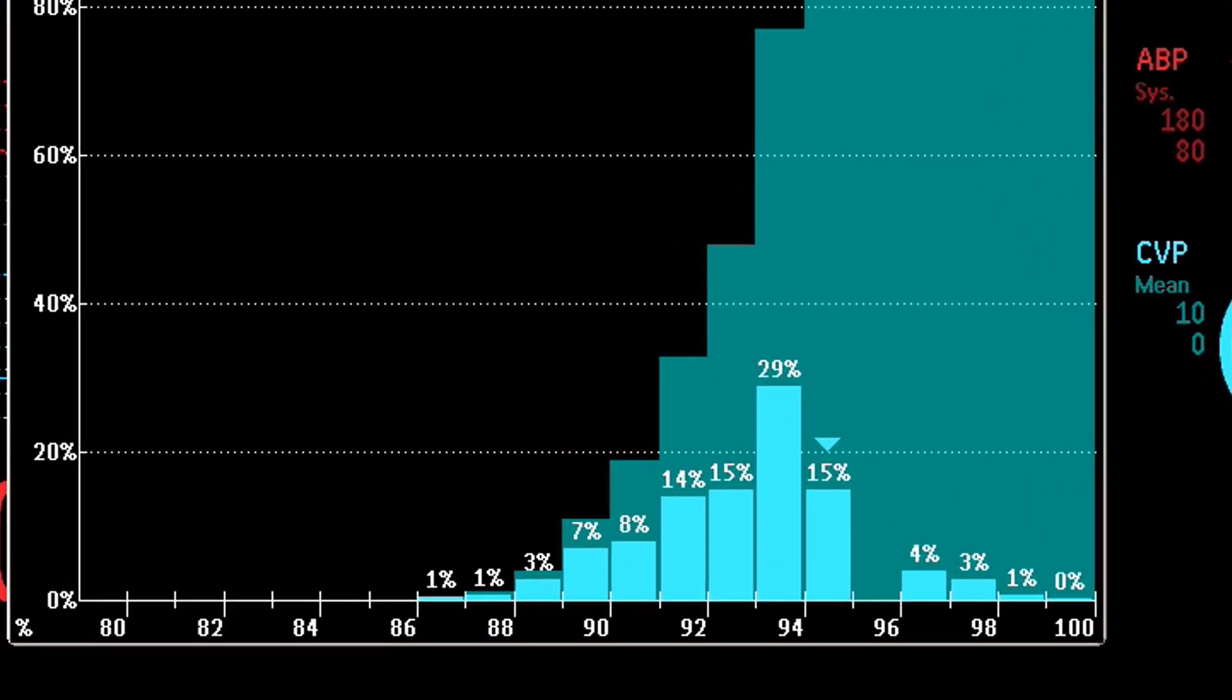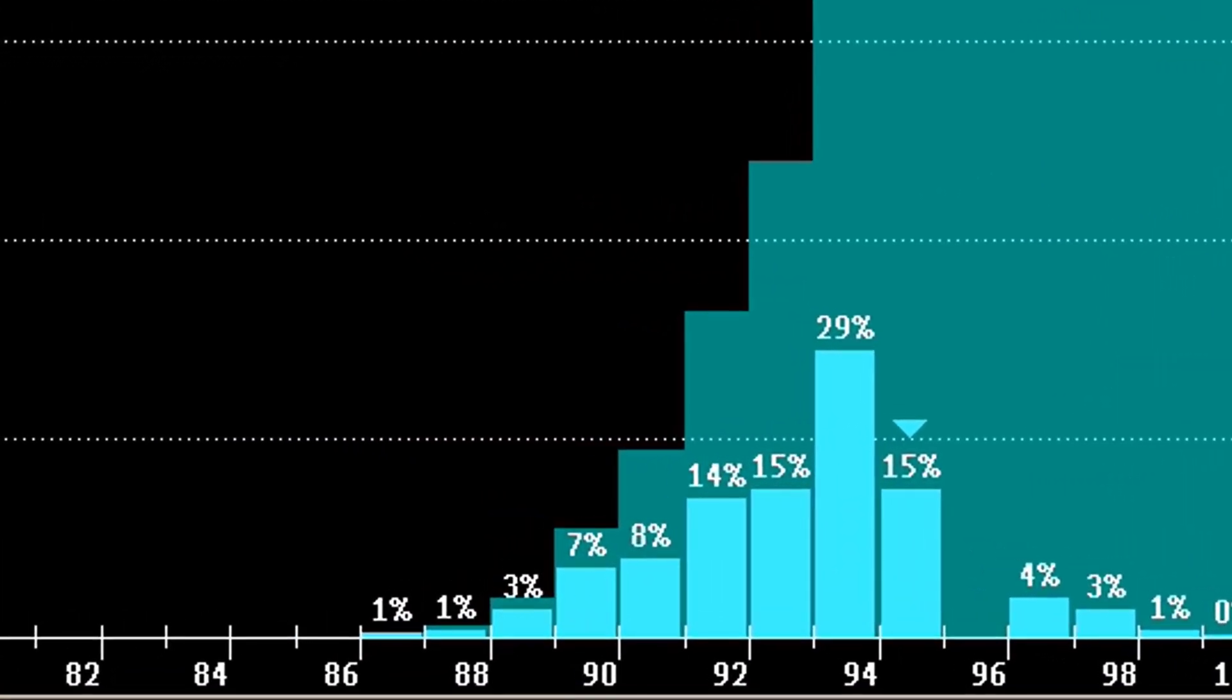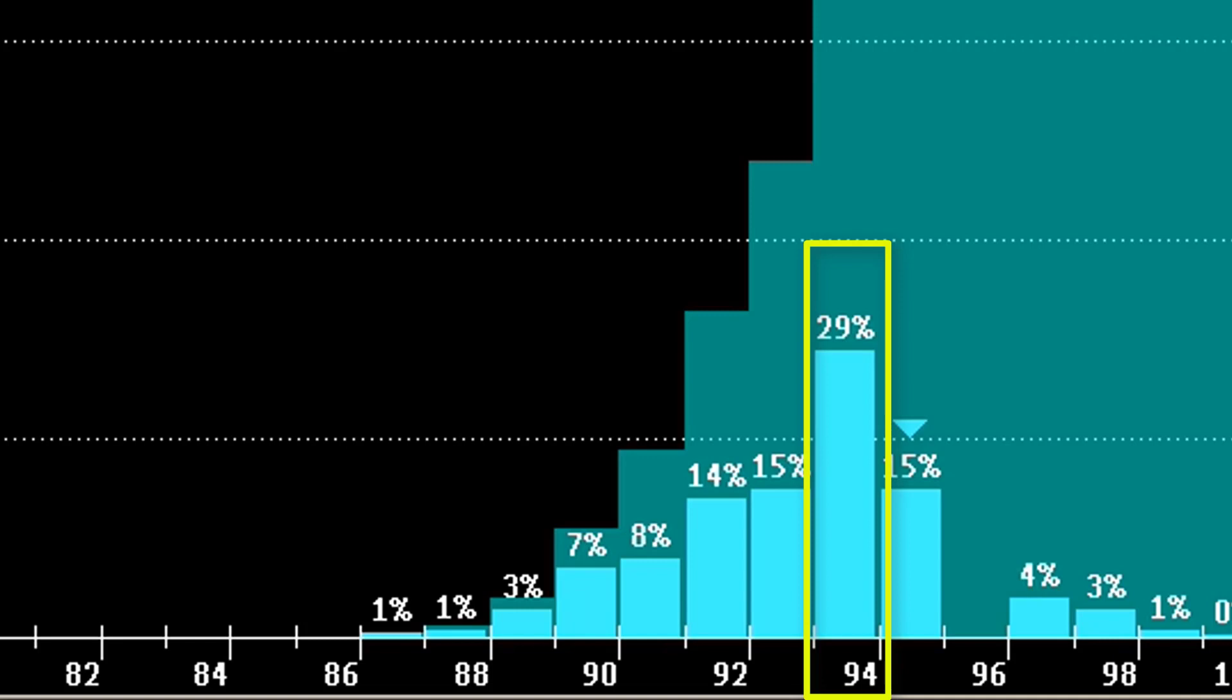The columns in the foreground show you how much of the time the measured values fell into this range. In this case, the SPO2 value was between 93 and 94 percent during 29 percent of the last 12 hours.